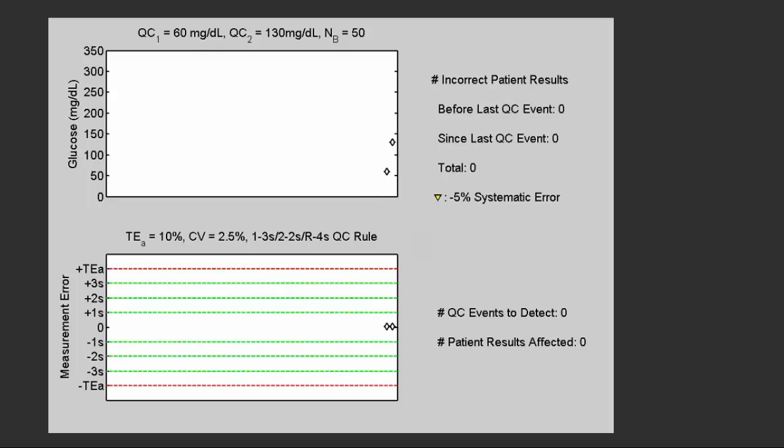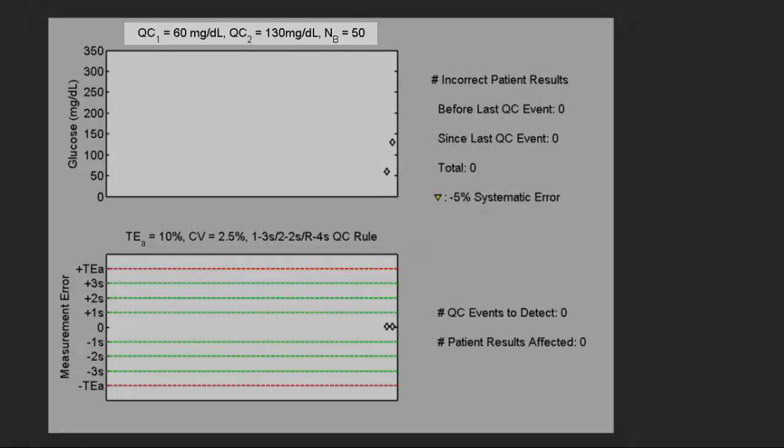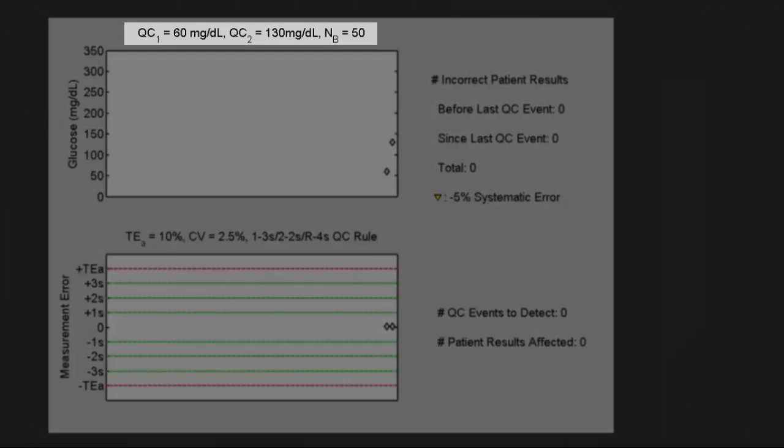The upper panel shows the same timeline for glucose results. The lower panel shows measurement errors, but now we are going to include quality control results as part of the testing stream. We're going to test two levels of QC material every 50 patient samples: level one is at 60 milligrams per deciliter and level two is at 130 milligrams per deciliter.